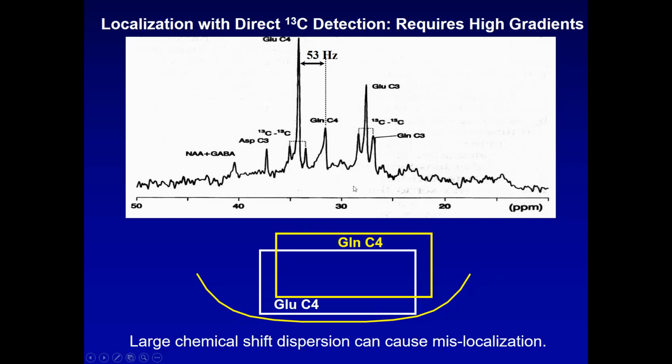So that's big compared to the frequency shifts among the chemicals. The gradient strength is high, and when the gradient strength is high, we need broad bandwidth pulses. To have a broad bandwidth inversion pulse, the pulse has to be short in duration. And if it's short in duration, it has to be powerful to achieve the proper tip of 180 degrees for the ISIS.